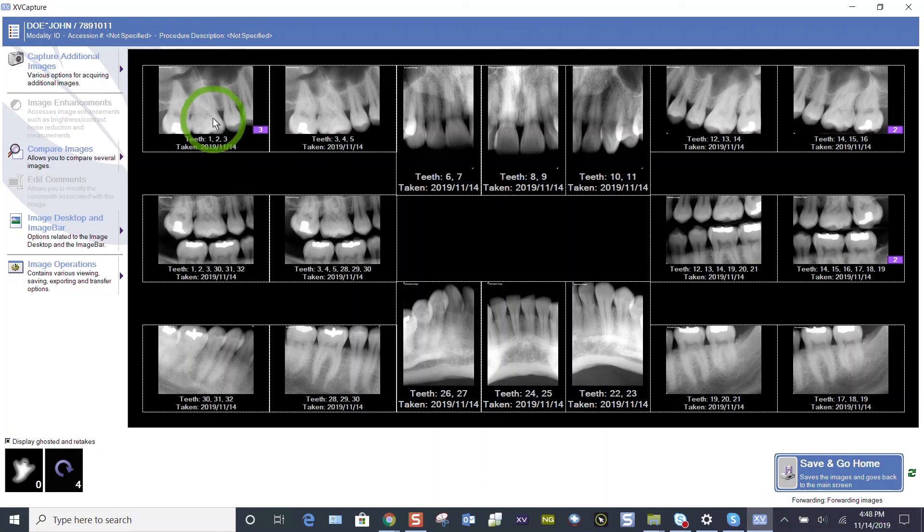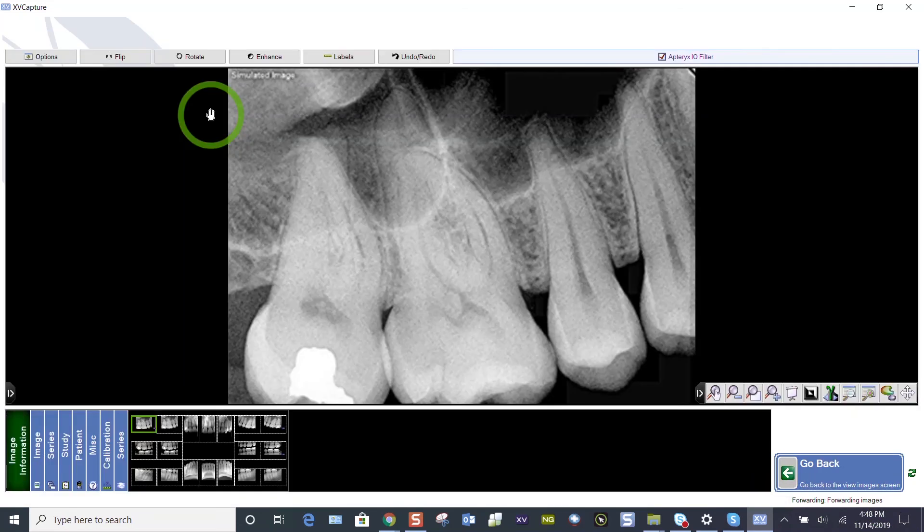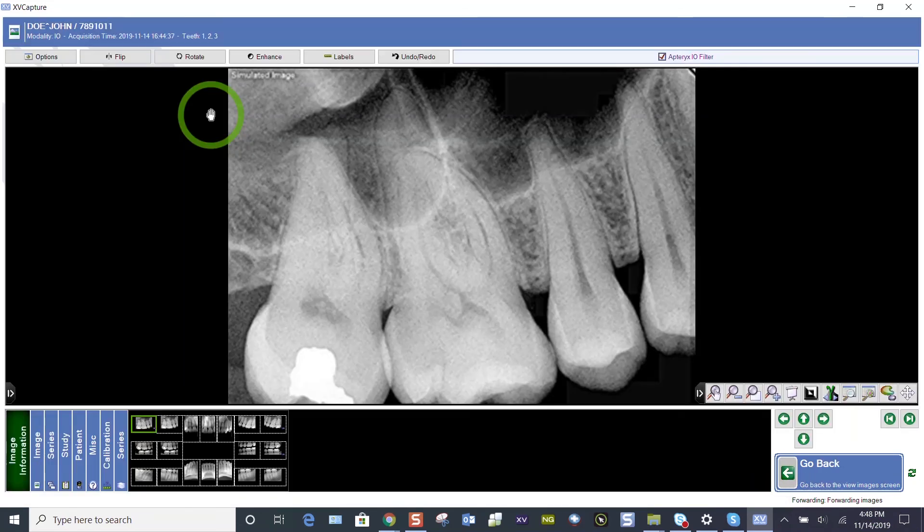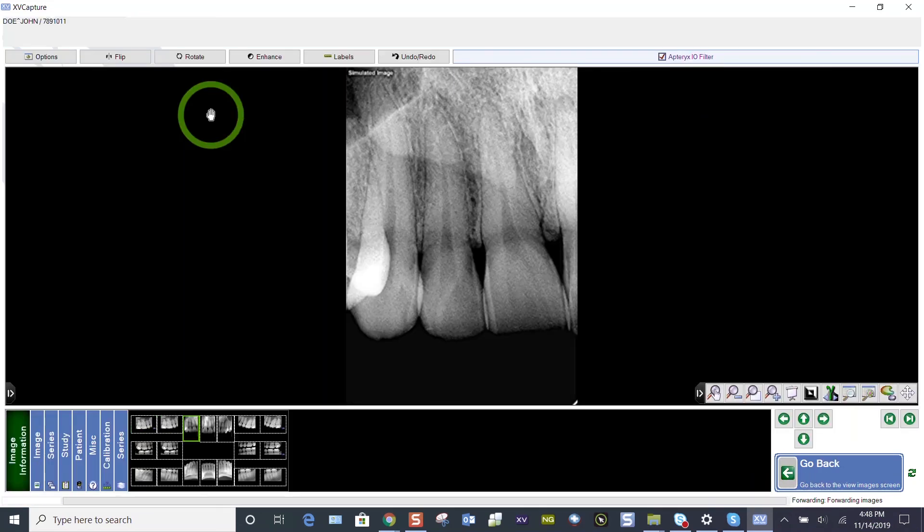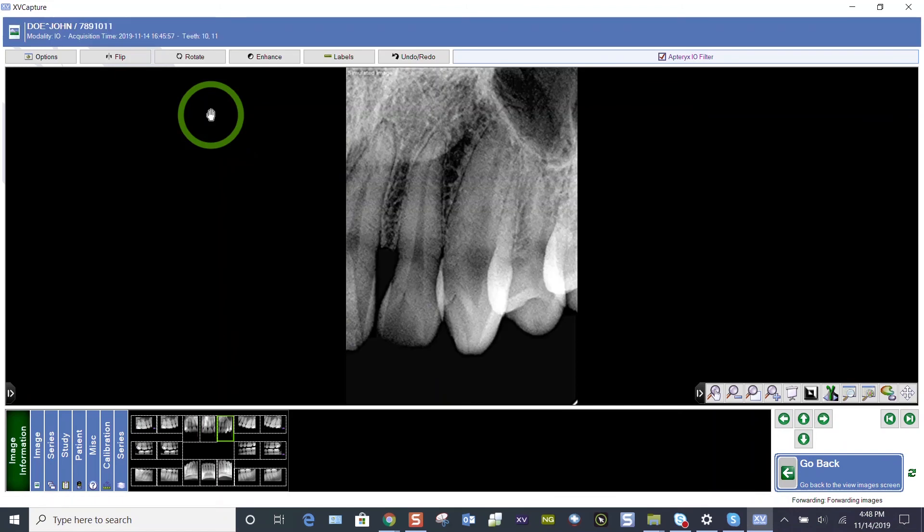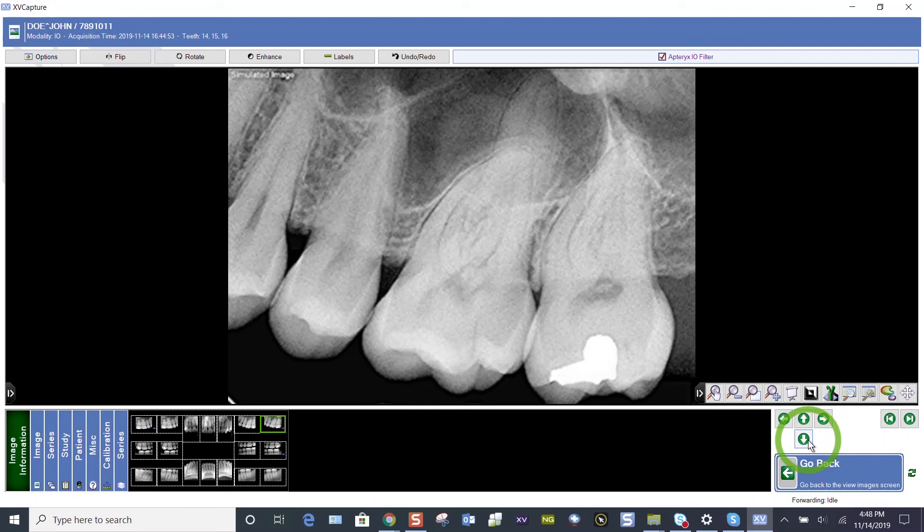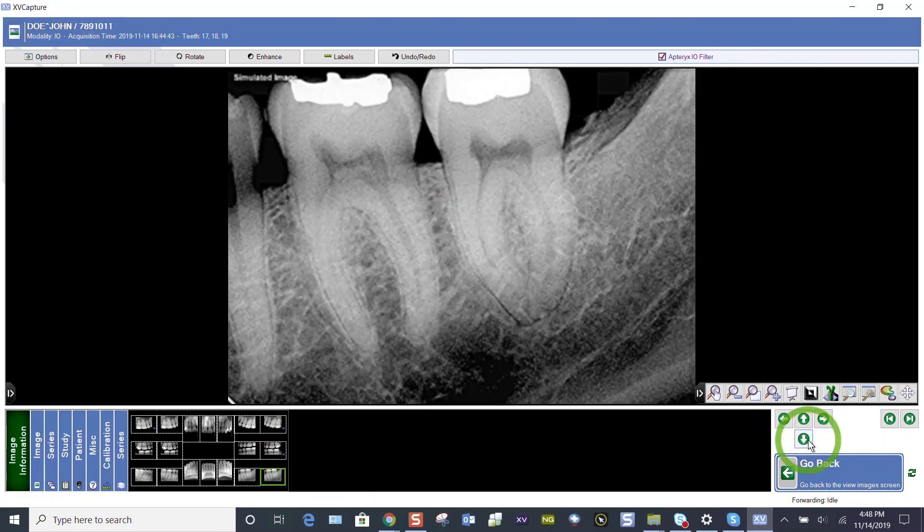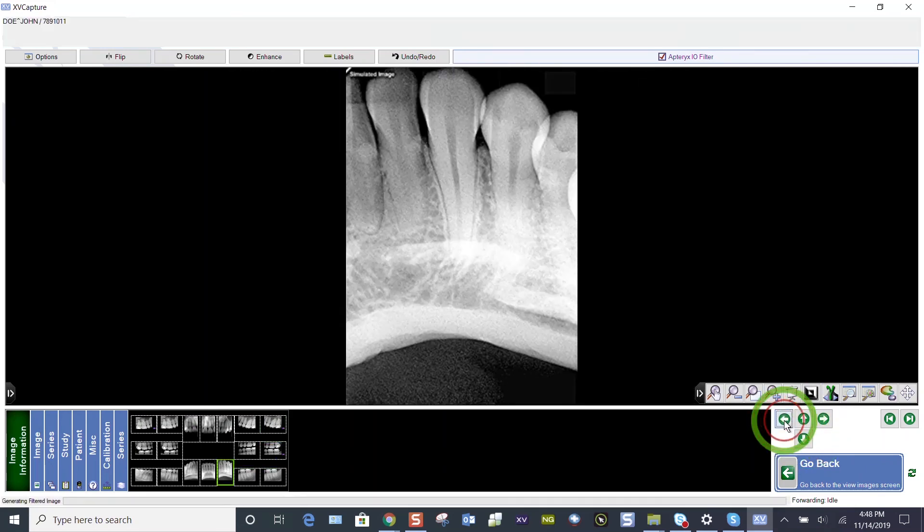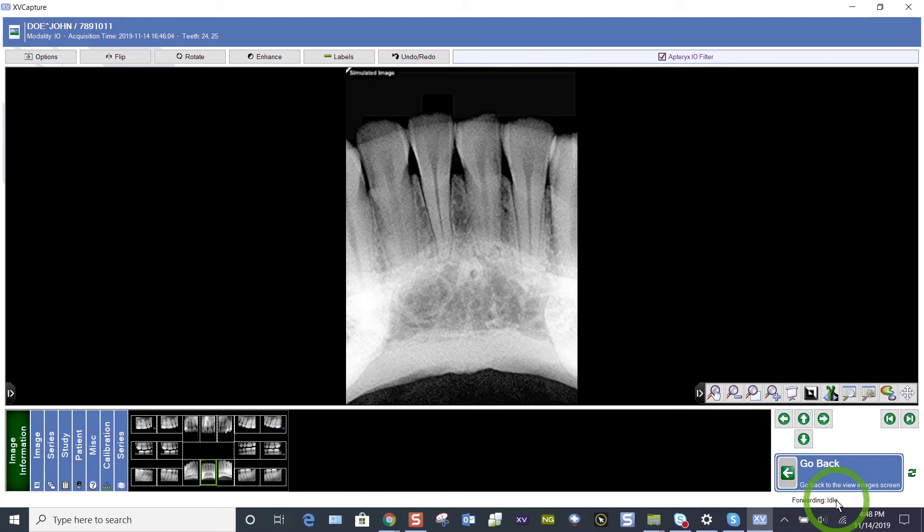You can double click on the image and start showing your patient their images. Use your computer keyboard arrows to navigate through. Use the arrows above, go back, go down, and to the left and to the right. And now that status is now idle. So that's changing. You don't have to stand there and watch it. You just want to be informed about it. That's going to push those images all the way out to your cloud-based server and make them accessible.